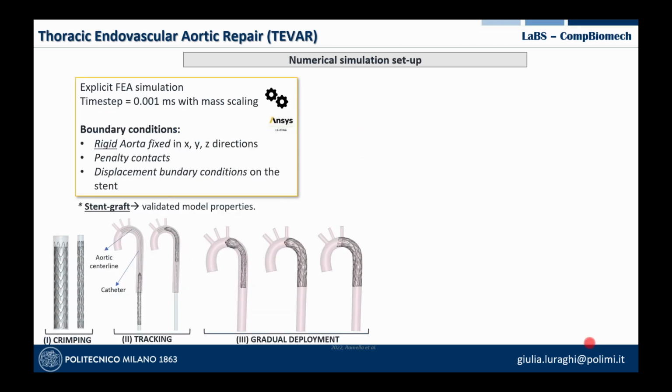After the implantation, we acquired CT scan images, so we can segment them to have a model of the segmented deployed configuration of the device to compare with our simulation. So we run the simulations with the commercial explicit solver LS-DYNA from the ANSYS package. We use an explicit solver with a fixed time step with mass scaling technique.